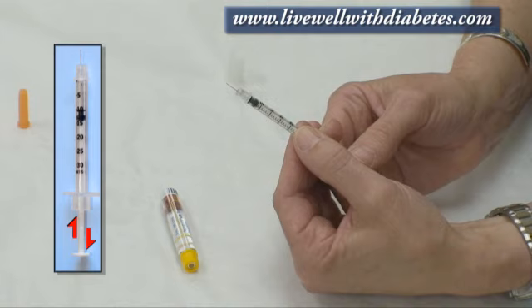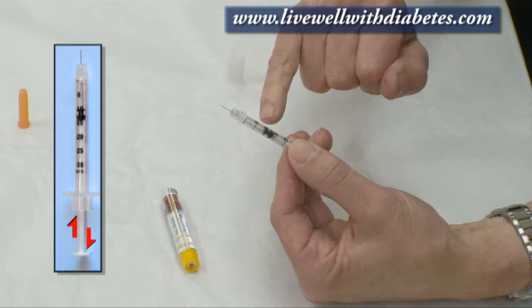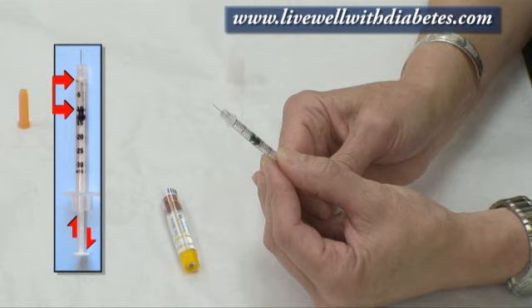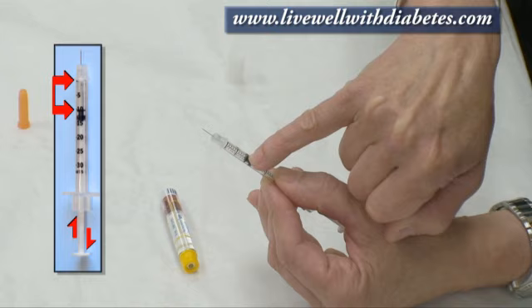When measuring insulin, I pull down the plunger and measure the space between the top of the black plunger and the top of the hub of the needle. If I wanted to measure 10 units, I'd line the black up with the number 10, and that space is now holding 10 units of air.